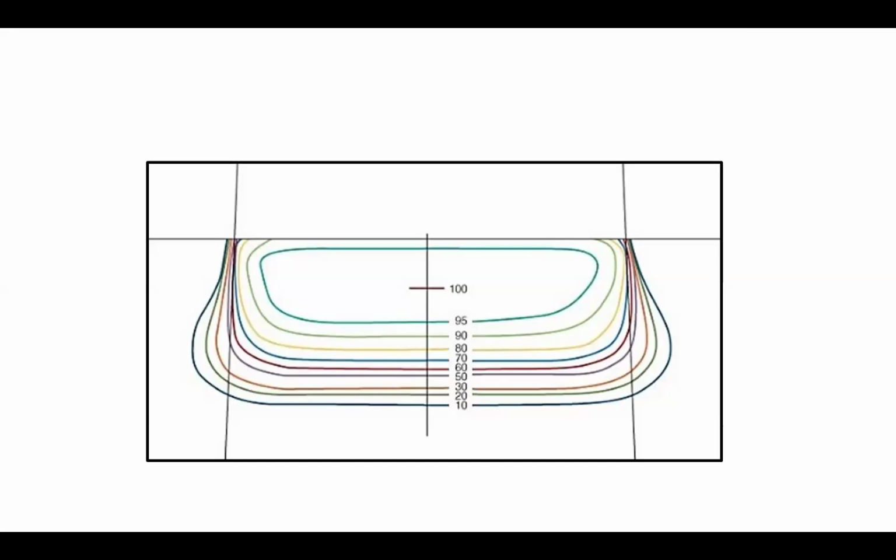So in this combination, I am using one field with photon and, immediately beside it, electron. What will happen? This spread, when it merges with the photon, consider this side is the photon beam and this side is electron. Now this electron dose is going inside on this side. This creates a hotspot. So we should be very careful while planning. You should give a 1 or 2 mm gap also. Nothing wrong. Some doctors will give it, some will take it. Understood? Yes, sir. So this will create a hotspot when using a combination of photon and electron fields. Someone is giving 5 mm, I read in the messages.